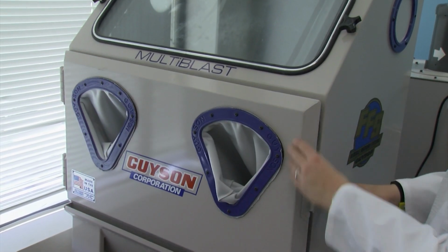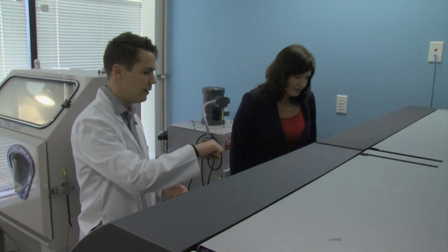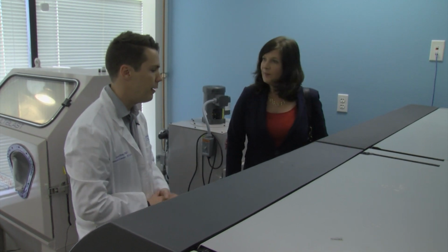This part will be a bit noisy. After printing, the models are put into an air blasting machine to blow off the excess. He says creating a spine with airways takes nearly 20 hours. The heart the size of my hand might be finished in about 4 hours.